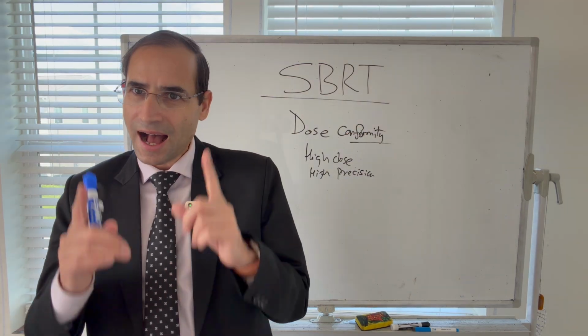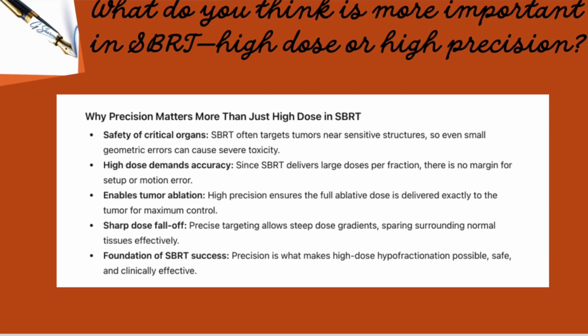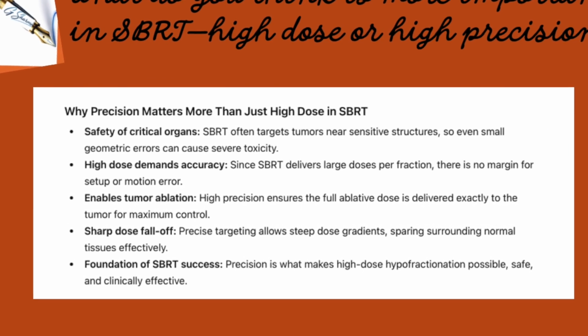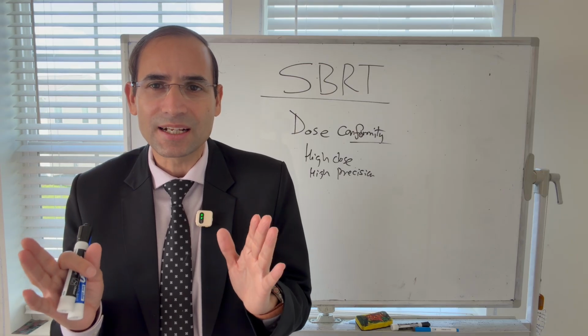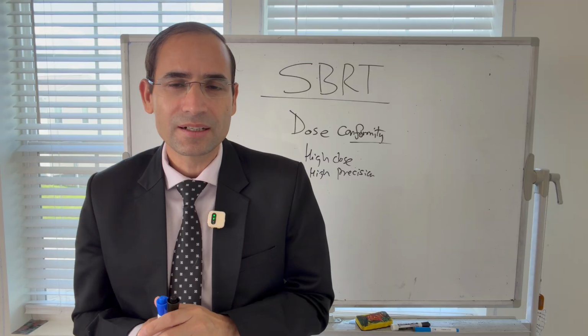What do you want? High precision. The answer is high precision. Definitely you will choose high precision. Without the precision, high dose becomes the problem instead of a solution. Remember that. So precision is a very important thing here.